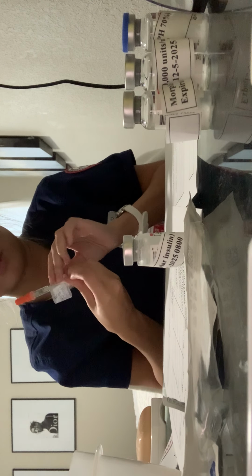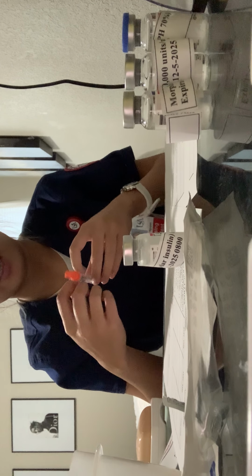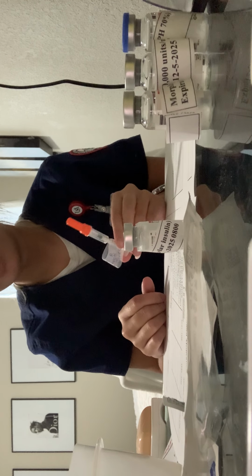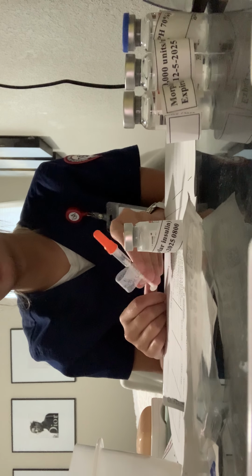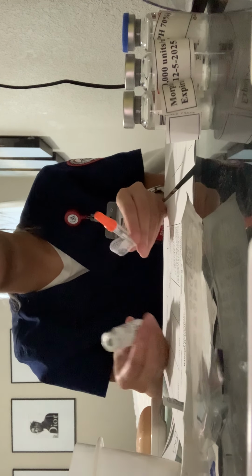And I'm going to ask a different nurse to verify for me, because this is insulin. So they're gonna verify the right dose, looking at the MAR and my syringe, making sure it's correct, and she said it's correct. So now, with my vial, my syringe, and my MAR, I'm going to do the 7 rights again.